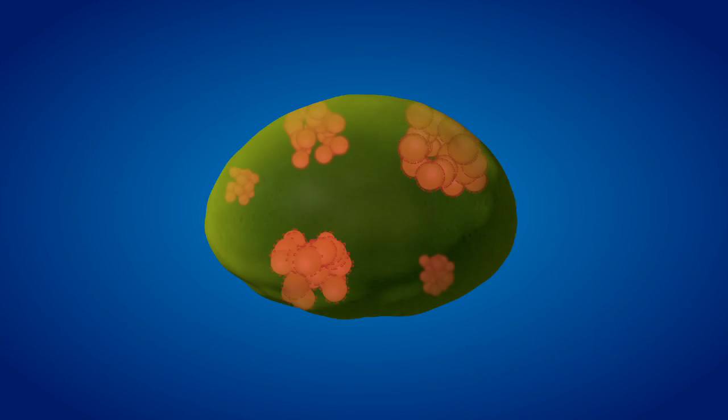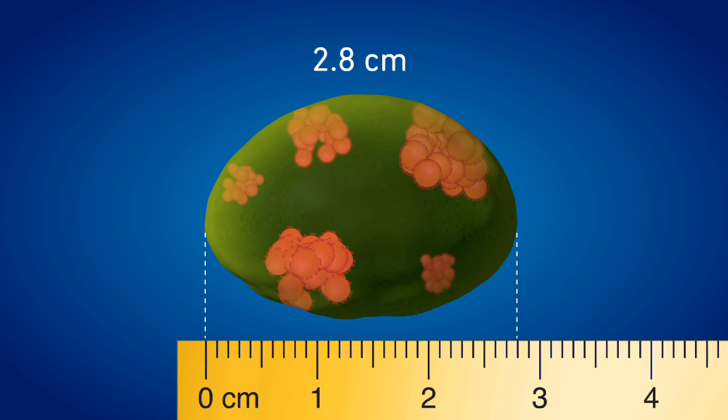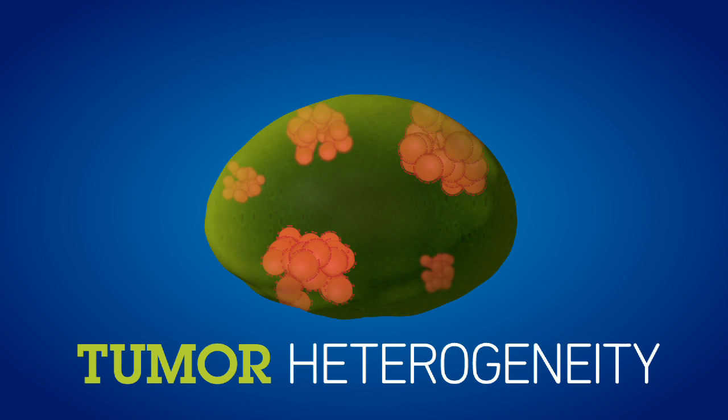As you can see, different regions of the tumor may express HER2 at different levels. This is the concept of tumor heterogeneity that may impact accurate HER2 testing.